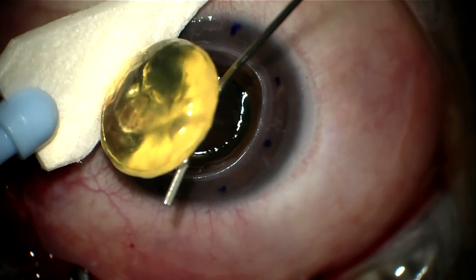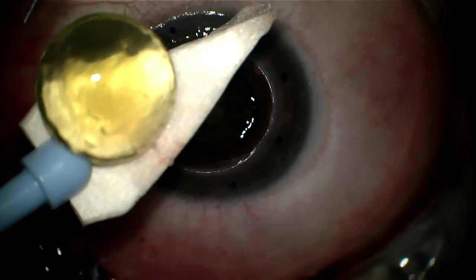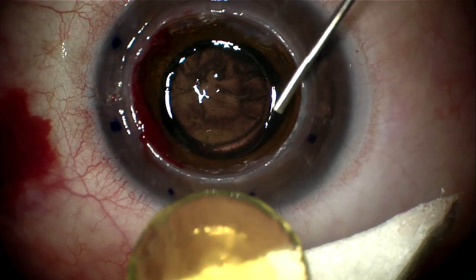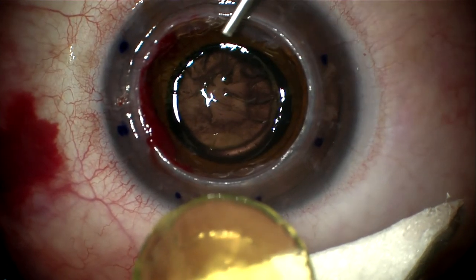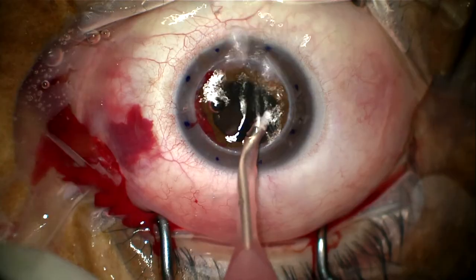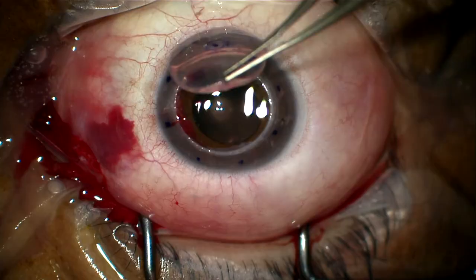IA removes the remaining cortex without concern of tags. The cornea is then sutured into position and the IOL is injected between the sutures into the bag or in the sulcus space. Precision pulse capsulotomy is extremely helpful in open sky triple procedures.